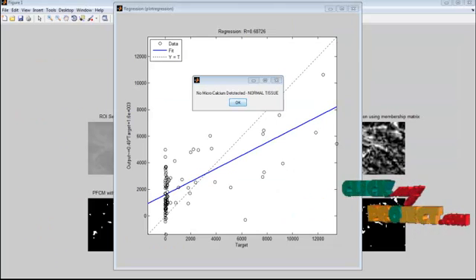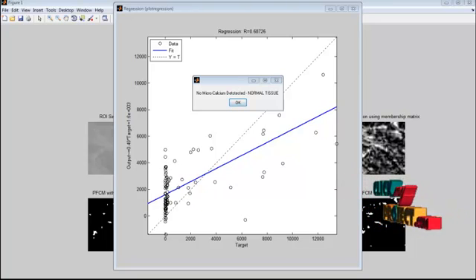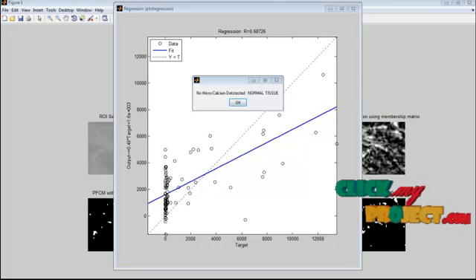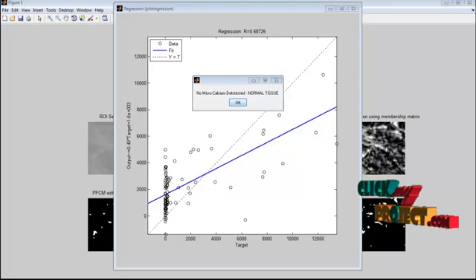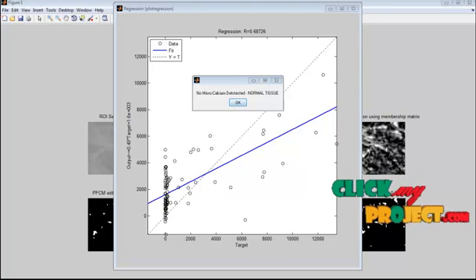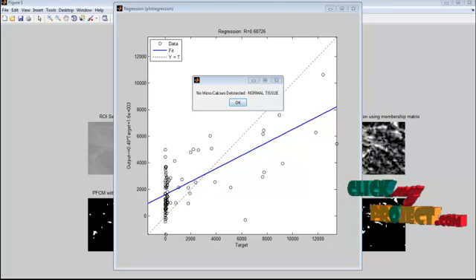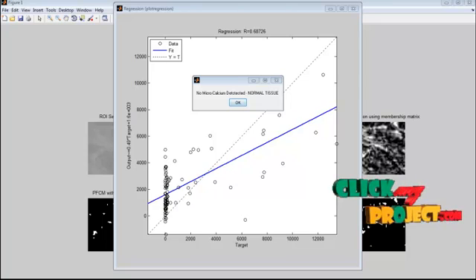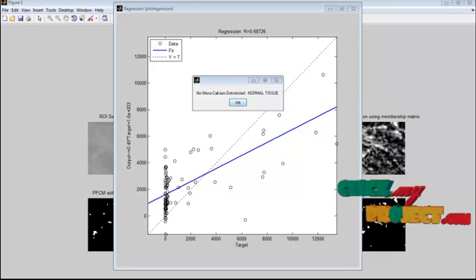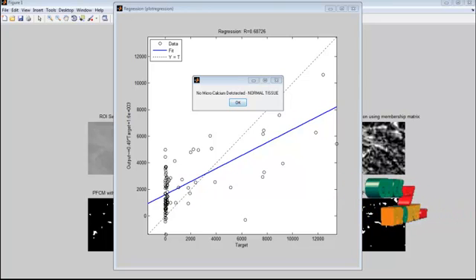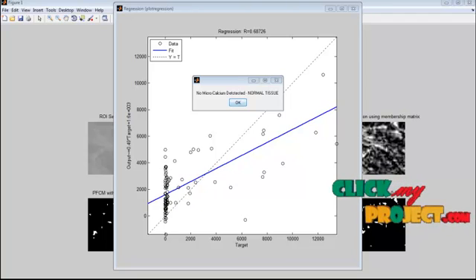This demo shows that our method automatically detects micro calcifications from the region of interest selected from digitized mammograms. According to the results obtained by applying our proposed method to these region of interest images, the implemented method can detect pixels corresponding to micro calcifications or healthy tissue, thus fulfilling the aim of this paper. Thank you.